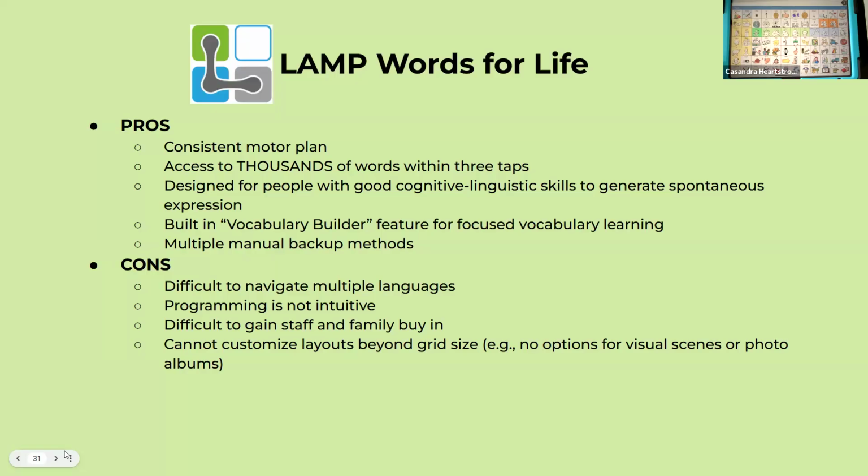You also have access to thousands of words within three taps. Thickly. I've never used "thickly" in a sentence, I just want you to know. It's designed for people with good cognitive linguistic skills to generate spontaneous expression, meaning somebody who's got a lot of words in their brain, they can express exactly what they want easily.